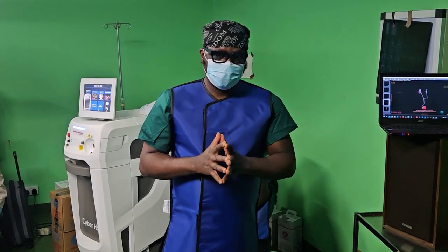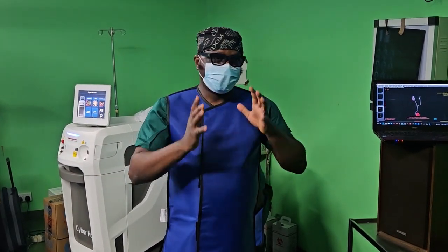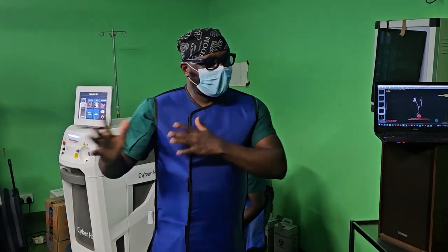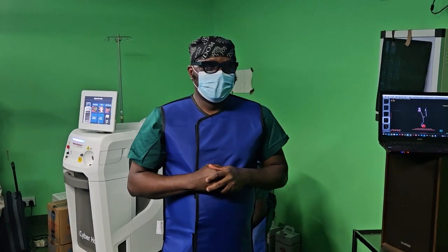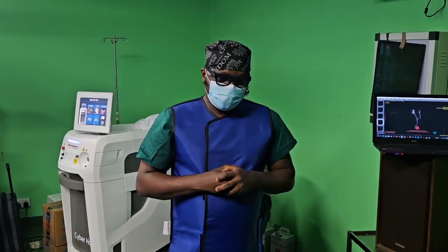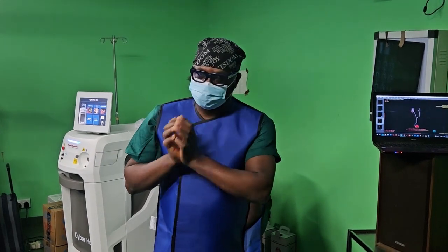We know that miniaturization of PCNL helps to reduce complications, because there has been a correlation between the size of the tract and the possible complications. That is predominantly the kidney tissue damage. Yes, renal nephron loss. And also infundibular injury, and so many other things. So the possibility of AV fistula. Yes. So miniaturization is key, and that is why mini PCNL reduces the complications associated with PCNL.